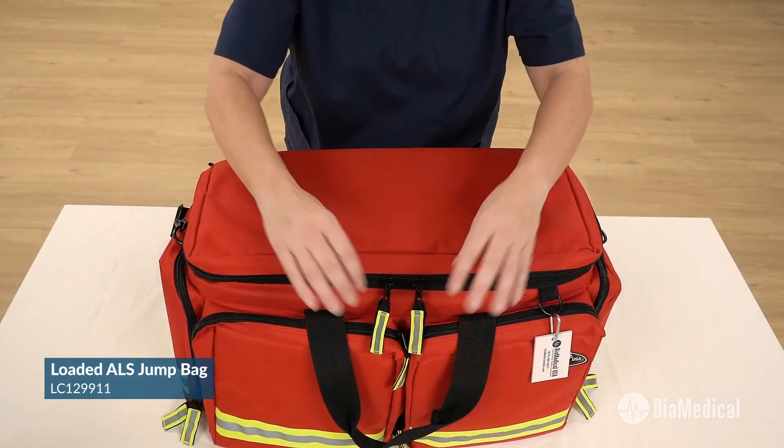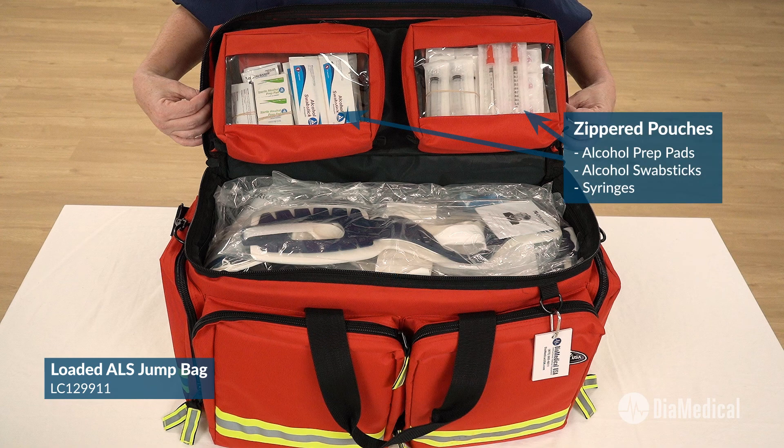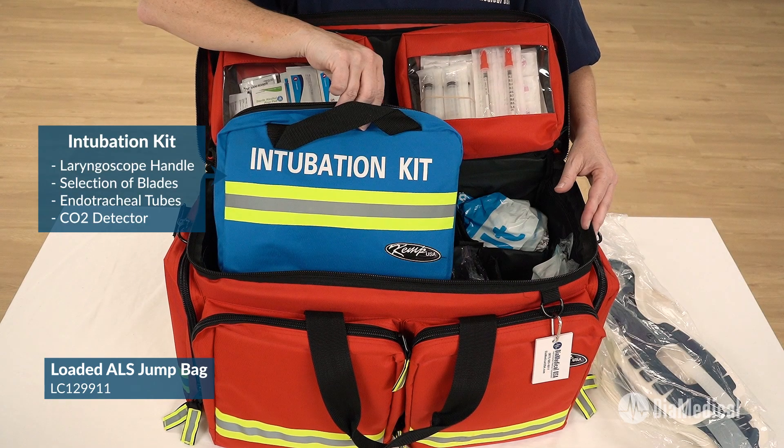The center compartment has enough space for the cervical collars, BVM, and other large items. It also includes SimRx simulated IV bags and IV tubing sets. Two removable zippered pouches with transparent windows provide quick access to commonly used supplies. The intubation kit is clearly visible in the bright blue pouch.